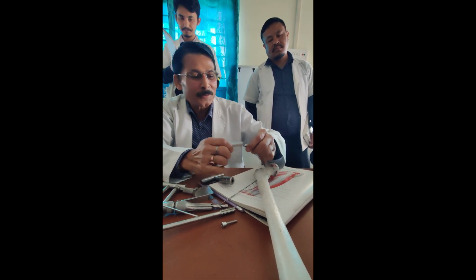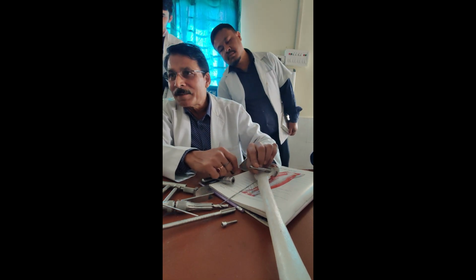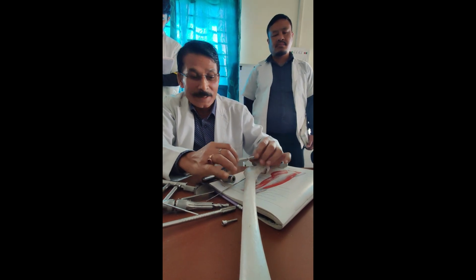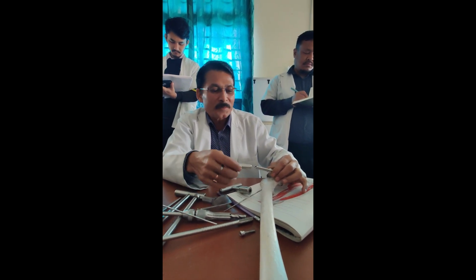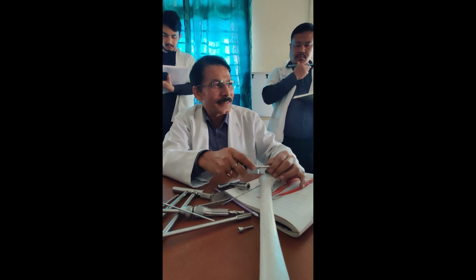It is a simple thing, but you have to understand that the flat part should be like this. Then it will go. Otherwise if you leave it like this, you struggle, it is not going to help you. You cannot do it. But if you know, then you can do it, put it there. Somebody used to go like this or that way.